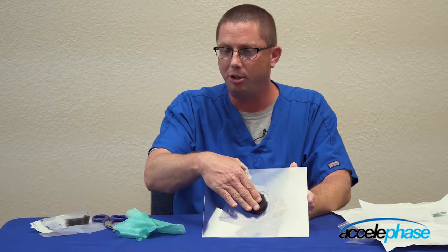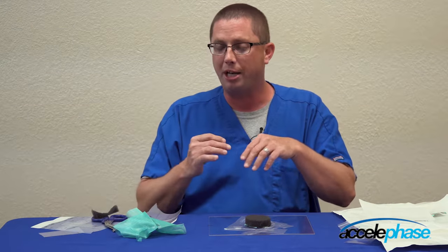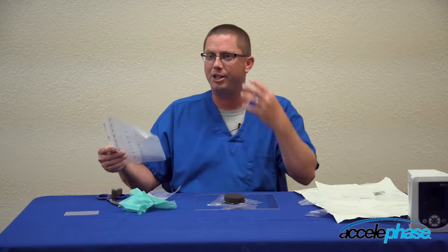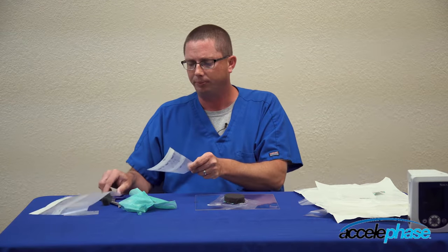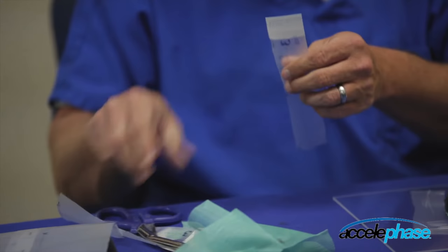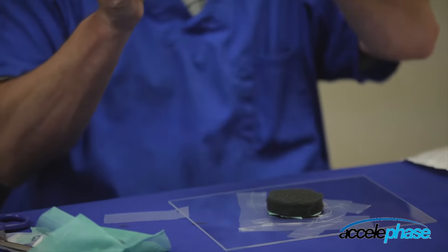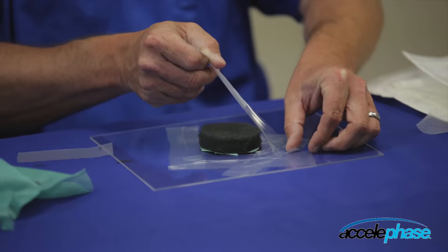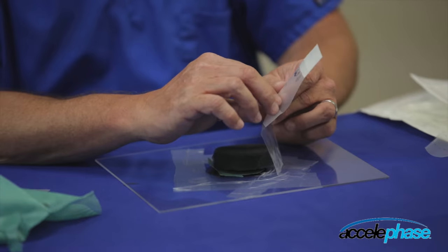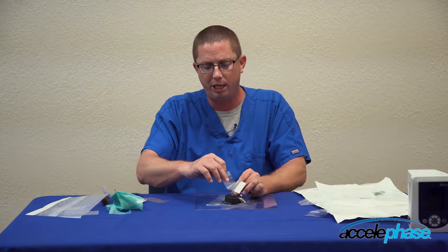From here, we need to cover and seal the wound base. We go back to our transparent film. My recommendation is always to fill any cracks and crevices first with your drape. Do not try to cover the entire wound with one solid piece of drape if it's a difficult wound — always cut a smaller piece. I start with a one-inch piece and go to the most difficult area. If there's a cracked crevice, I cut a little one-inch piece, take my thumb, and push down into that cracked crevice, because that's where I'm going to leak. Negative pressure wound therapy is nothing more than applying vacuum to the wound base.